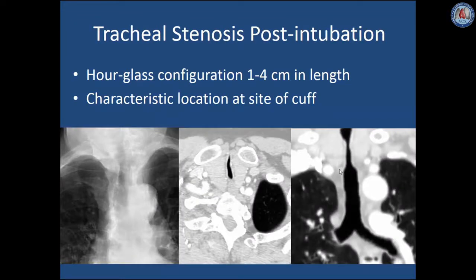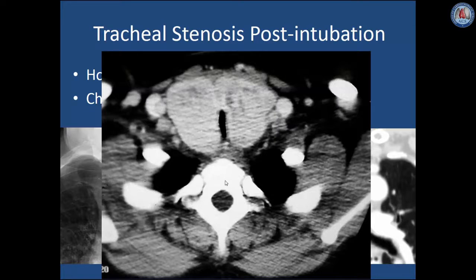There are a number of entities that cause tracheal narrowing. Post-intubation tracheal stenosis is represented as an hourglass configuration, generally one to four centimeters in length, that characteristically occurs at the site of a cuff. It will be seen in the proximal trachea as an hourglass narrowing on a chest radiograph, with the correlate on coronal CT imaging as a smooth concentric narrowing with a typical hourglass configuration. On the axial image one can see significant stenosis at the level of the thoracic inlet. CT is useful in differentiating this stenosis from narrowing caused by extrinsic compression by an adjacent mass, most commonly caused by enlargement of the thyroid gland, as in this case with diffuse thyroid enlargement causing tracheal narrowing.